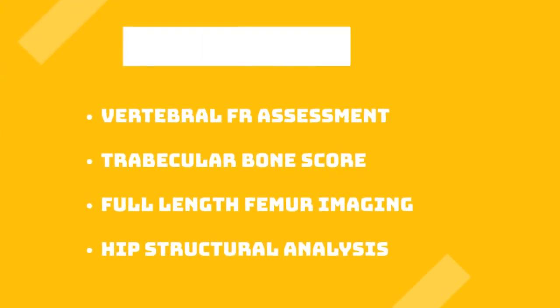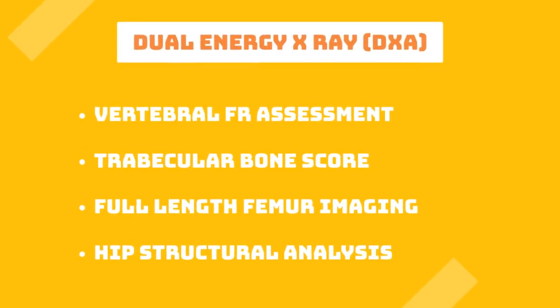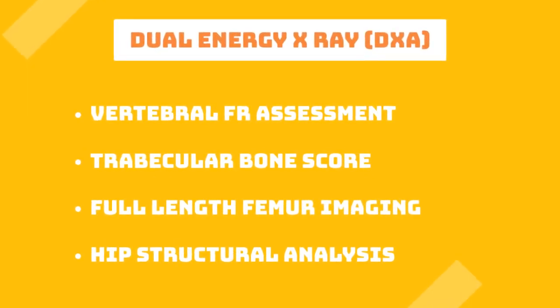DEXA scan can be used to evaluate bone health in ways beyond the measurement of bone density, like vertebral fracture assessment, trabecular bone score, full length femur imaging, and hip structural analysis.